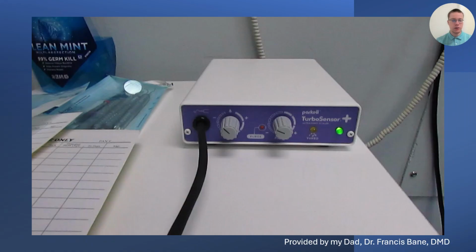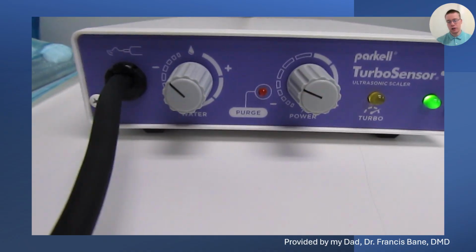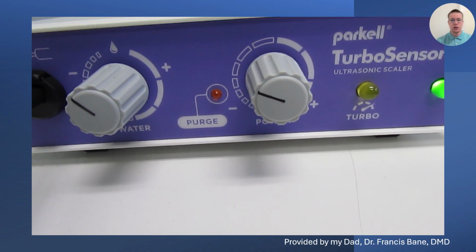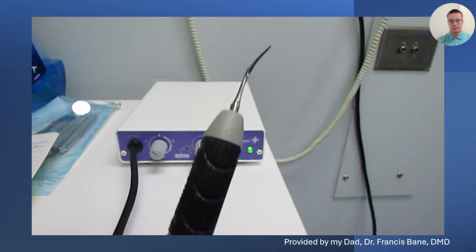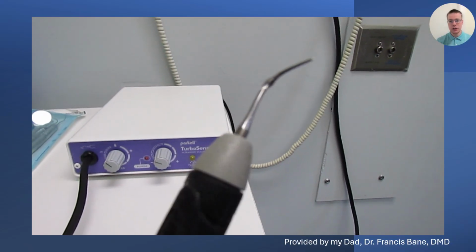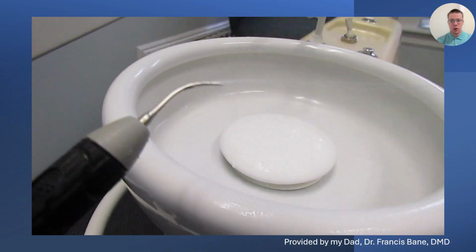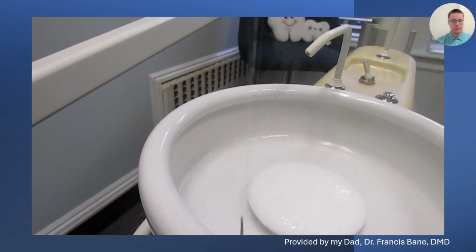Here you can see a brief video of an ultrasonic scaler that my dad uses in his office. There you can see the tip, and now you can see it functioning with the water stream there.